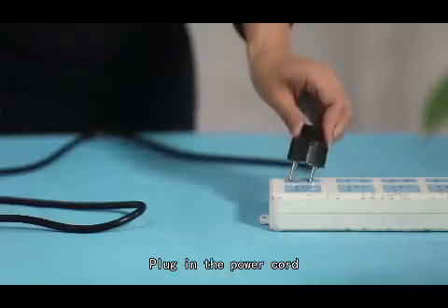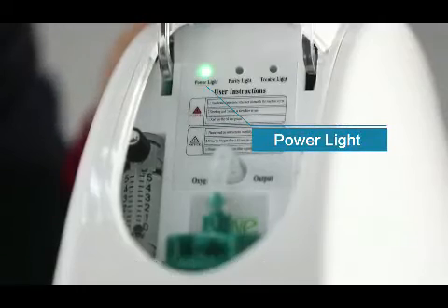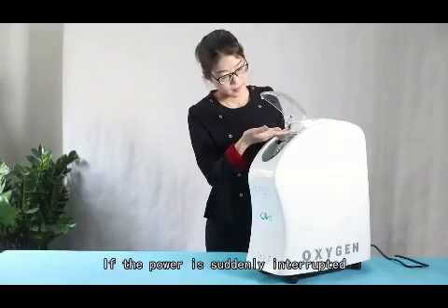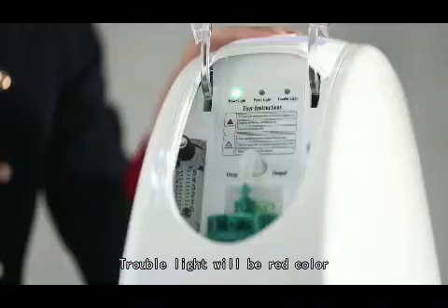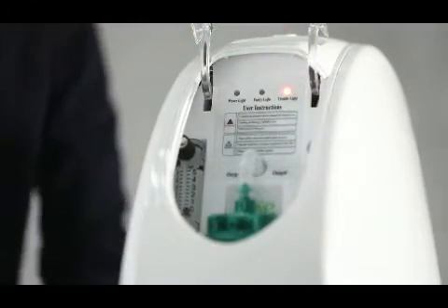Plug in the power cord. Press the on and off button. The power light will be green. If the power is suddenly interrupted, the trouble light will turn red and send an alarm sound.